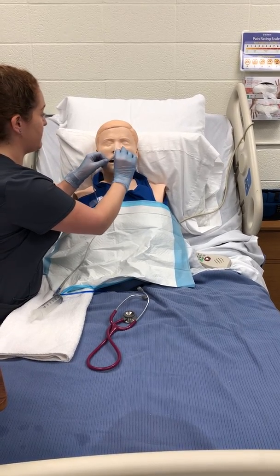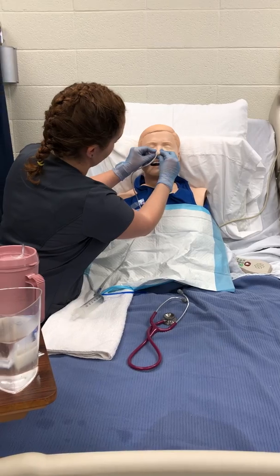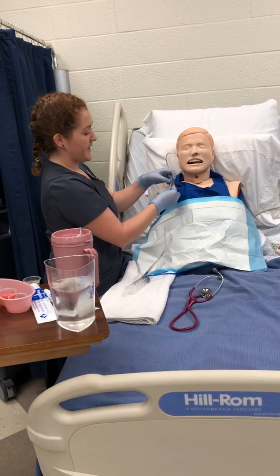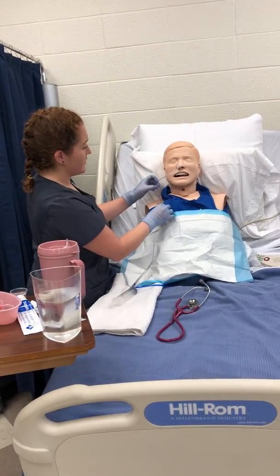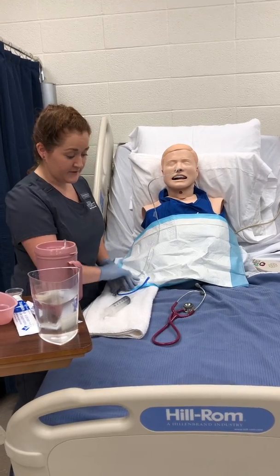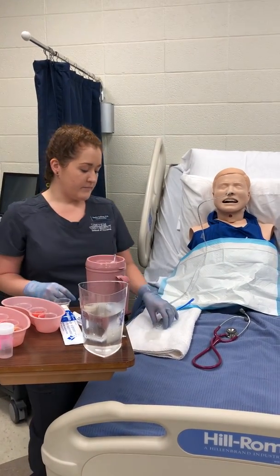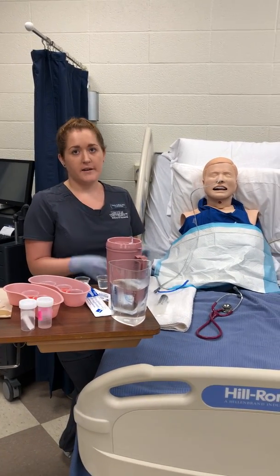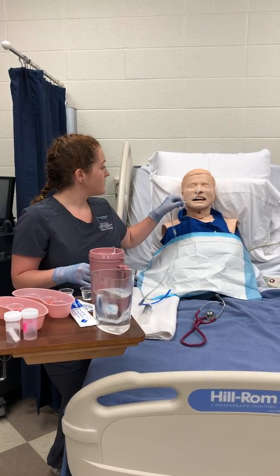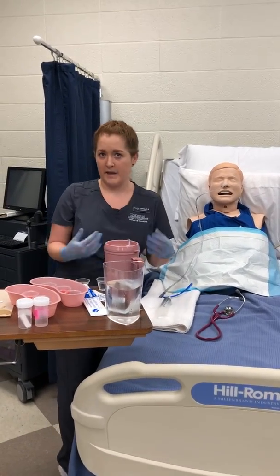I want to make sure you don't use too much tape, but that you also are not letting the tube rest directly on the patient's skin so that skin breakdown doesn't occur. I want to make sure it's comfortable for the patient. And then I'm also going to secure it to the patient's gown using a safety pin and a piece of tape, so that they do have enough range of motion to turn their head. If we did have a clamp, it would be clamped off at this time to prevent excessive air from flowing in. Now that I've placed the tube, I have documented all relevant data — how the patient tolerated the procedure, the gastric contents that were aspirated, the pH, and the level at which the NG tube was inserted to, so that any nurse can check later and see if the tube has possibly slipped out of place.